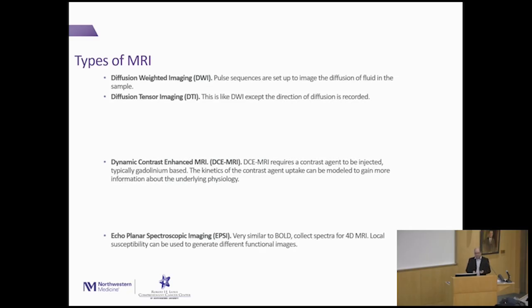It's a really interesting image. I think it was on the cover of Nature or Science. Anyway, now with the improvements in computing power, we can do that in a human. Back then, what they left out of the news with that monkey brain images is that they imaged it over a weekend. So it was, I want to say, a 36 or 40-hour scan. So that's obviously not happening with a live animal or human.